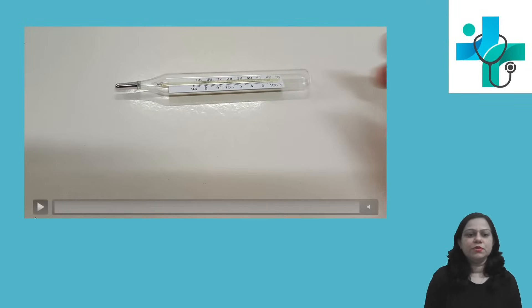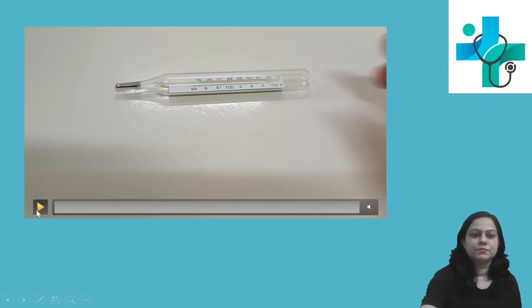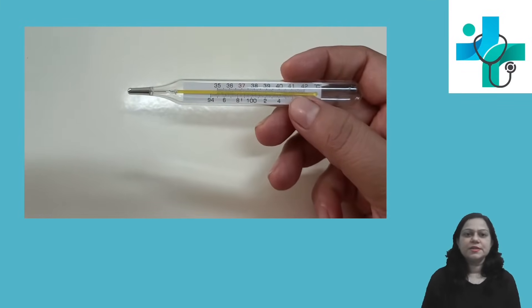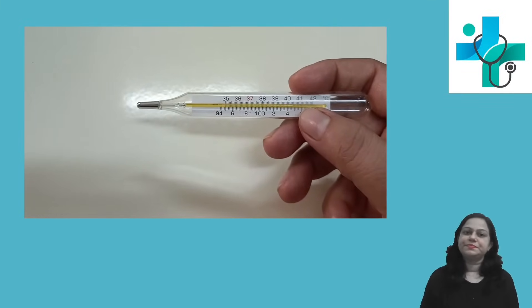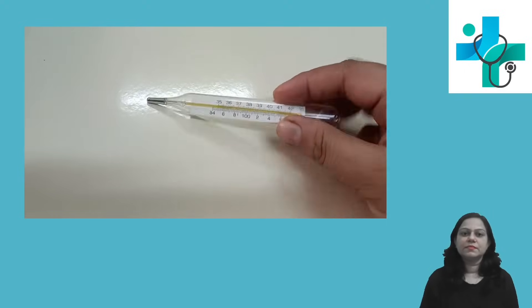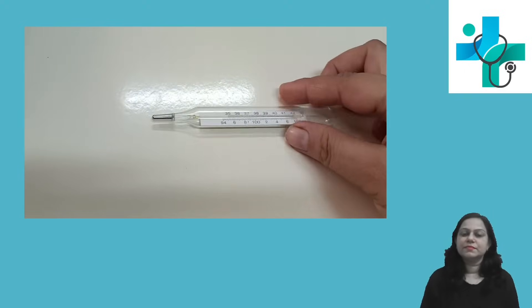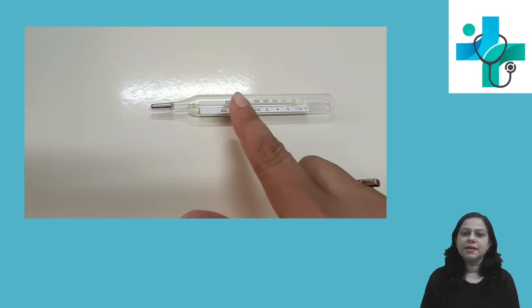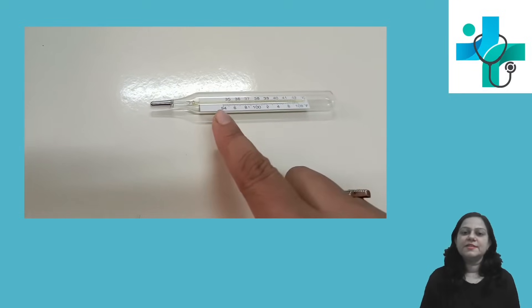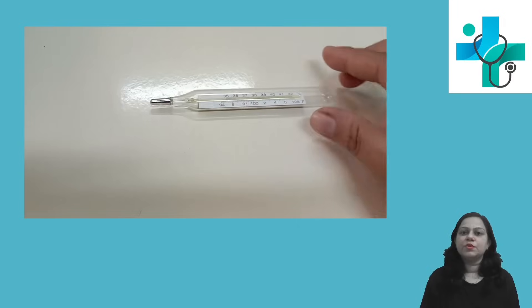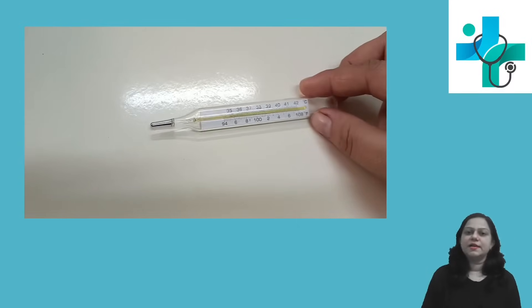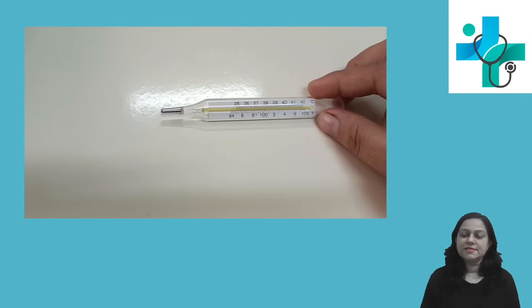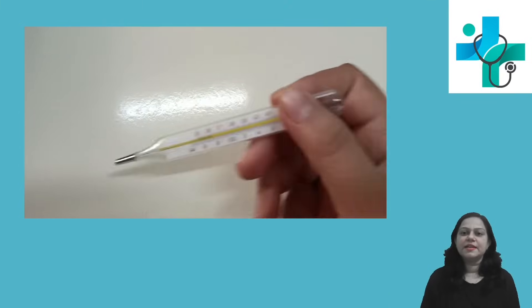In the video, see the instrument and the tip. There is mercury and the mercury will be raised in this column. On both sides you can see markings — one marking is in degree Celsius and on the other side it is in degree Fahrenheit.